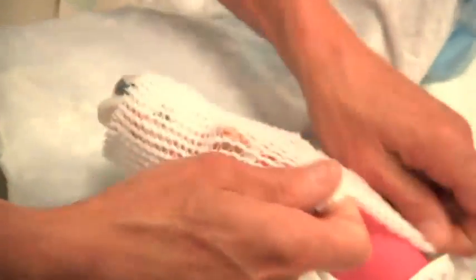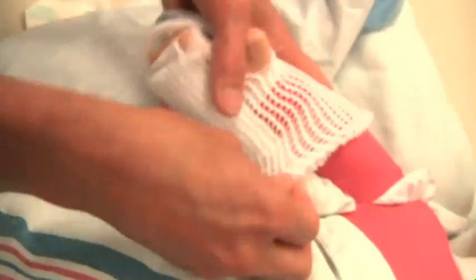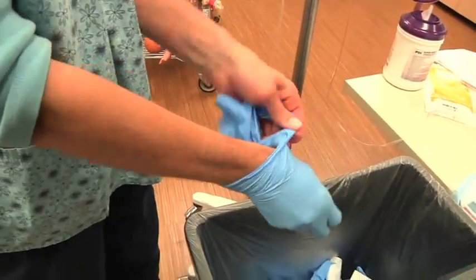Finally, apply the SurgiNet netting over the top of the peripheral IV and the board. This will help to secure the extra tubing. Remove gloves and perform hand hygiene.